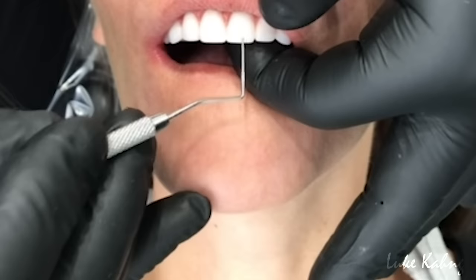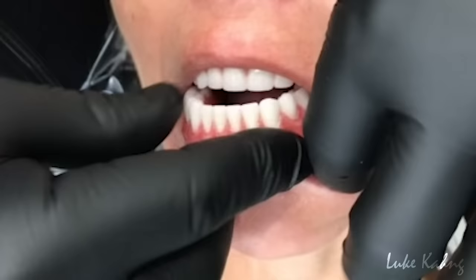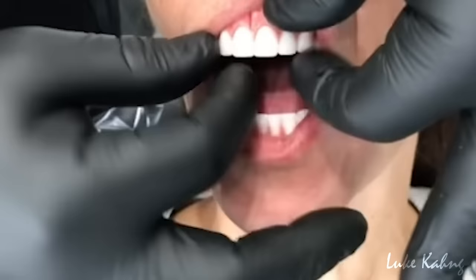And then also, she can't close. Right down, she can't close. See, she's forcing to close. She can't close. Got that? See that? She can't close. So now, open.